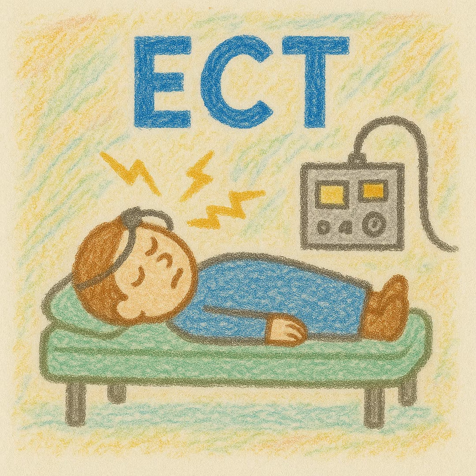The anesthesiologist may use a little electrical stimulator to assess the paralysis. You could also check their reflexes, just get a reflex hammer and hit their knee and see if they are areflexic. Once they're anesthetized and paralyzed, they're not able to breathe.